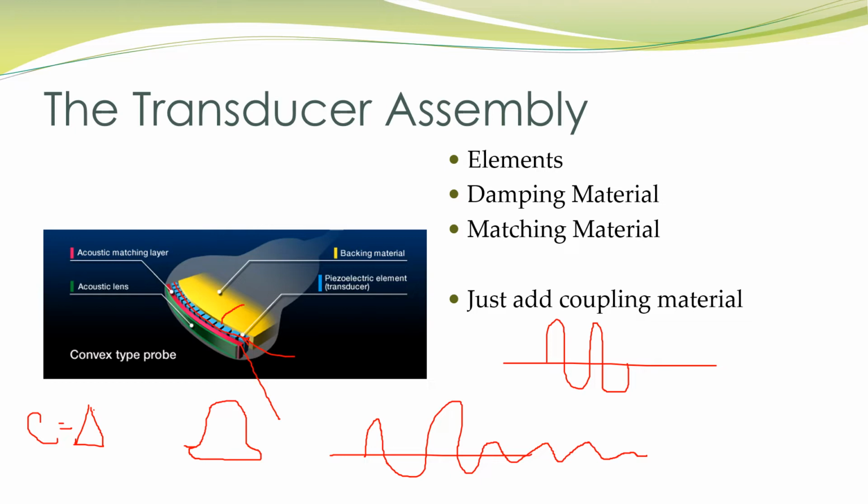part of your image. Now this one shows an acoustic lens, which isn't necessarily utilized as a large part of our probes that we're using currently. So I'm going to just leave that out of our discussion today.